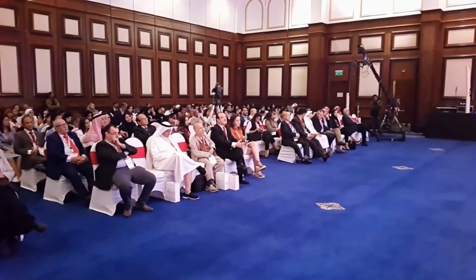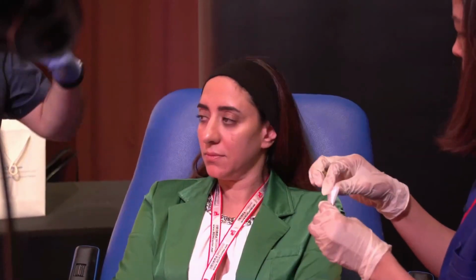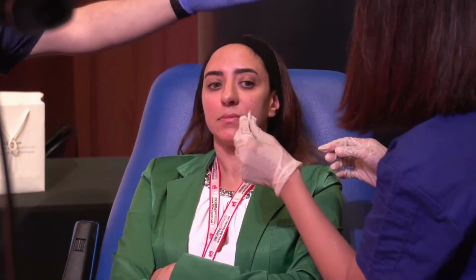I'm left-handed. I usually inject the lips from the left side. The face, if I injected the first model on the other side, I usually go to the other side. It's very hard to inject from one side all the products. You can't assess the anatomical area very well.